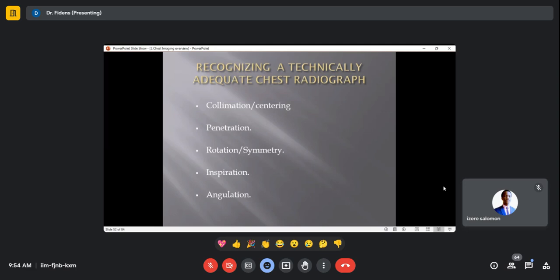So especially that can happen for patients who are not cooperative, in the ICU with portable X-ray, or patients too sick to be positioned very well. So that's what you call angulation, and you should check for it, because if there was angulation, you can wrongly call a pneumothorax, or an opacity somewhere, or miss one. Those are 5 things you should normally check before you start analyzing.